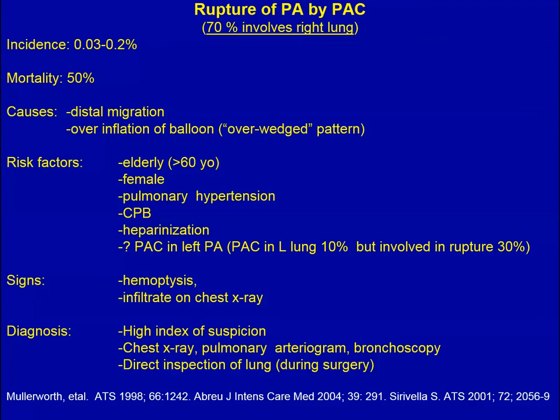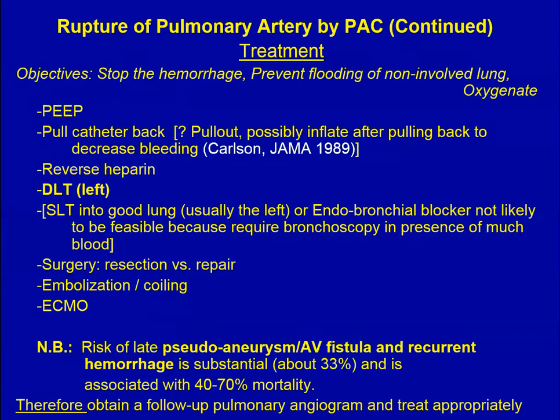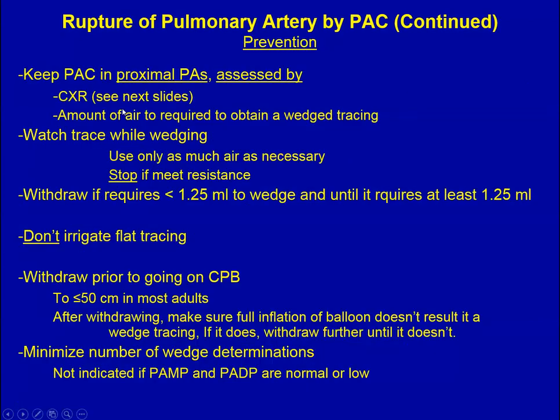On this slide, I have listed some of the causes and the risk factors, the signs, and how one might suspect it. On this slide, I have summarized the management of ruptured pulmonary artery catheter. However, prevention is more important.